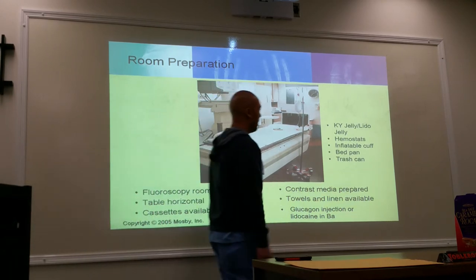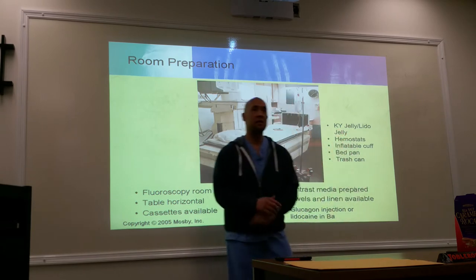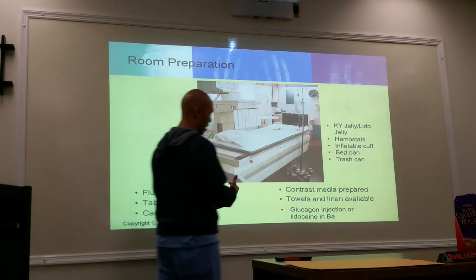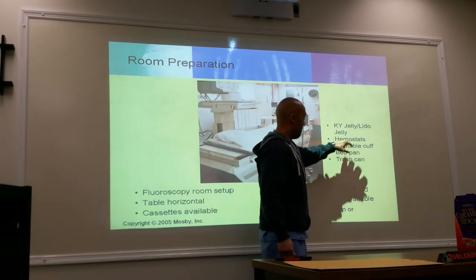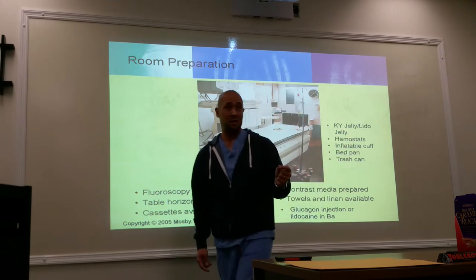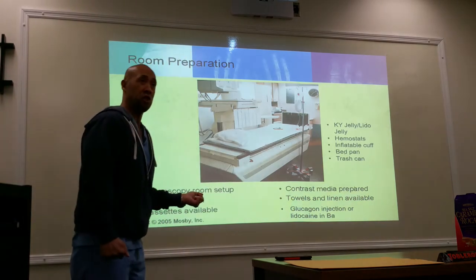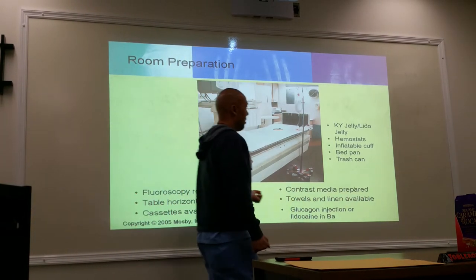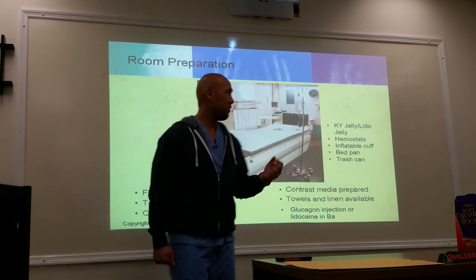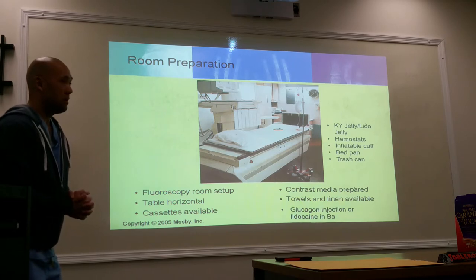I think I also added some type of lubrication. KY jelly is very common in our radiology department. It's a very good lubricant, and it is water soluble. Lidocaine jelly should also be available because you may be tipping somebody who has hemorrhoids. Yeah, ouch. So lido jelly is good with patients who have some type of anomaly going on in their backside.